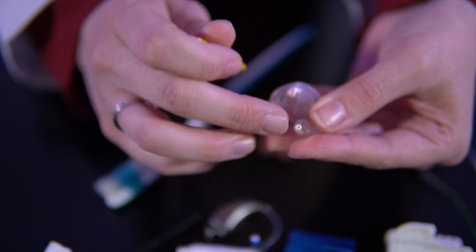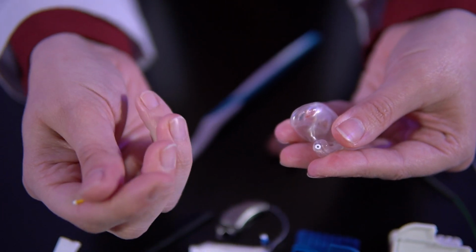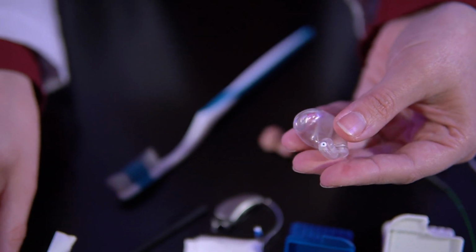It'll pop off, and sometimes there is wax around there, so again, you can take your cloth, wipe it off, switch it around to your clean end, and replace it. And then you'll just discard your stick, okay?